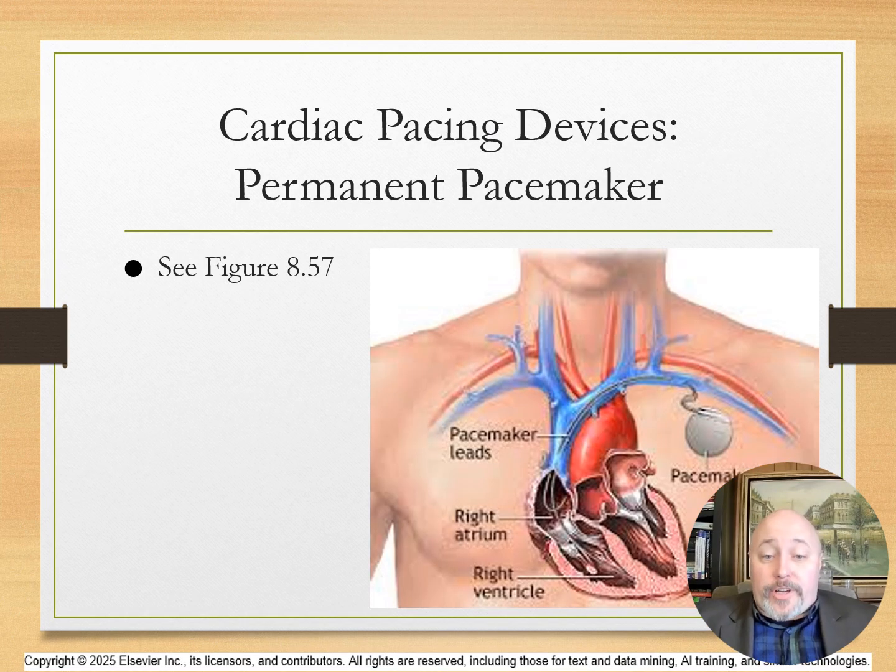And here is another diagram representing the permanent pacemakers that may be used to stimulate the atrium or ventricles. Atrial pacing is used to mimic normal conduction from the SA node and to produce an atrial contraction, thus providing that atrial kick. Ventricular pacing stimulates just ventricular depolarization, and is commonly used in emergent situations or when pacing is required infrequently. Another option would be dual chamber pacing, which allows for stimulation of both atria and ventricles as needed to synchronize the chambers and mimic a normal cardiac cycle.